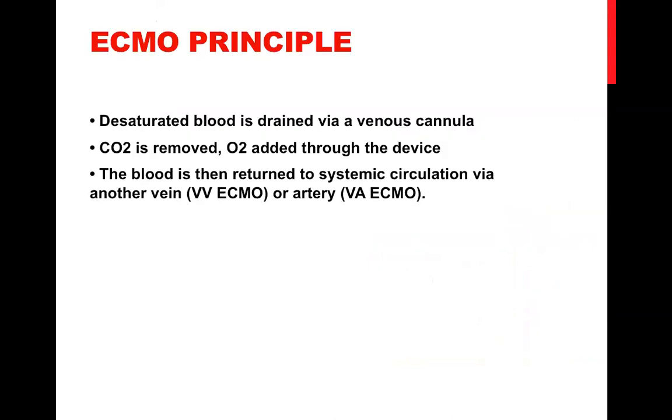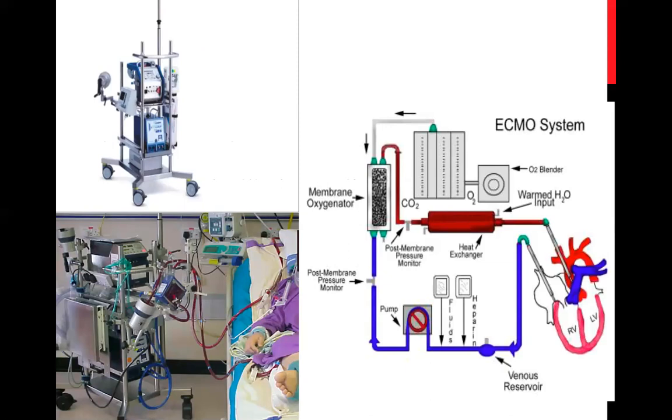Sorry, Abdullah, just to add one more thing regarding the extension of cardiopulmonary bypass. You have to know this is a closed circuit. Under any circumstances, you do not add any stopcock and utilize it for whatever you need. If you need ultrafiltration, then you have to add it in the venous line, not in the arterial line. If there is any small bubble that travels into the circuit, it is going to be somehow filtered in the membrane oxygenator, however you are not going to count on that. So you use that in high-risk severe cases. Keep in mind, this is a completely closed circuit. No one is allowed, from the ICU, cardiologist, cardiac surgeon, perfusionist, or ECMO coordinator, to utilize the blood in the circuit for venous or arterial blood gas.